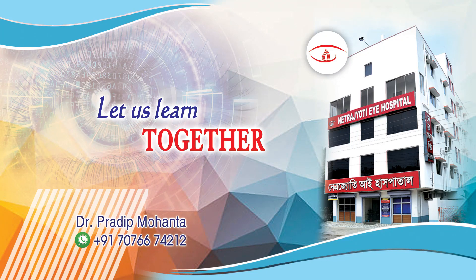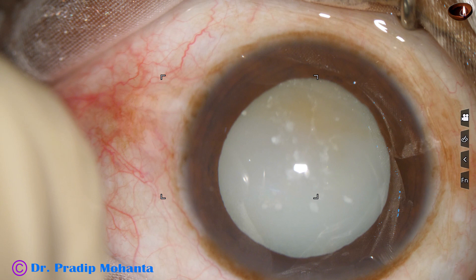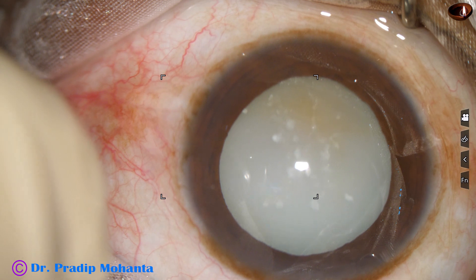Friends, welcome to my workplace at Ranaghat, West Bengal, India. This is a hypermature morganian cataract. Let us observe this surgery.